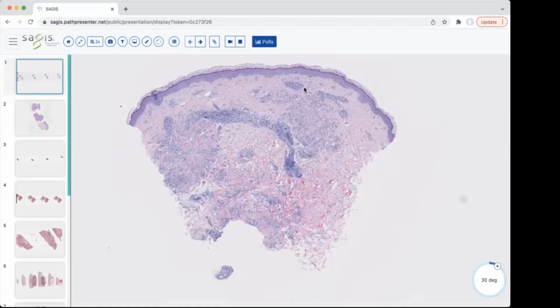And then lastly is foreign body granulomas. Foreign bodies are a little bit confusing because sometimes you'll have a palisade around the foreign body in the dermis, but those granulomas are marked by foreign body type giant cells. They have those large cells with abundant cytoplasm and haphazardly arranged nuclei.